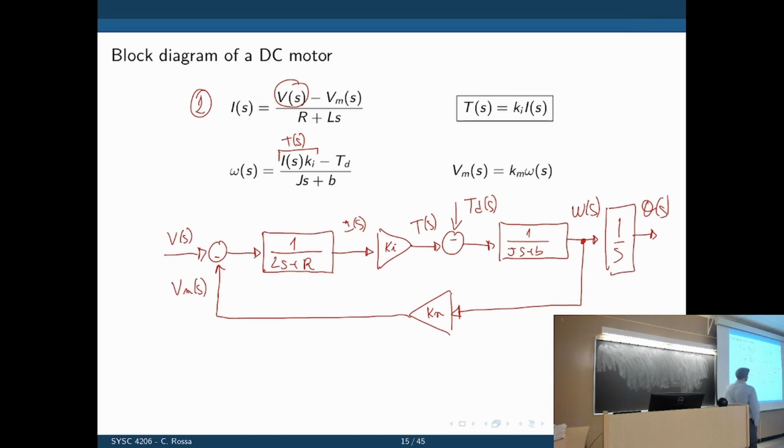Well, we are controlling essentially what comes out here. So we are controlling the current. We know the relation between current and the torque. So if I want to apply a certain torque, T, what's the current I need to apply that T? It is T divided by Ki. So if the desired torque is T, if I divide T by Ki, this gives me the magnitude of the current I need to deliver that torque for an individual motor. So when you're doing torque control, we are in fact controlling the current in the motor.